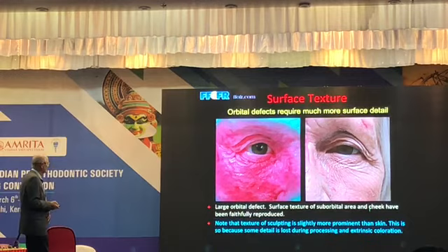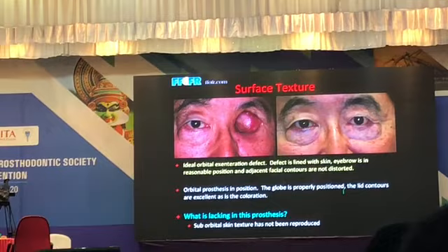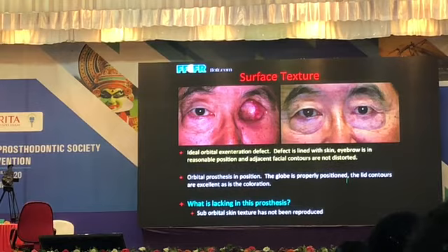So the texture of the sculpting is slightly more prominent than what you see in the skin. And I showed you this before, right? Now you know the answer. What's lacking in this prosthesis is the surface texture of the skin of the suborbital area.